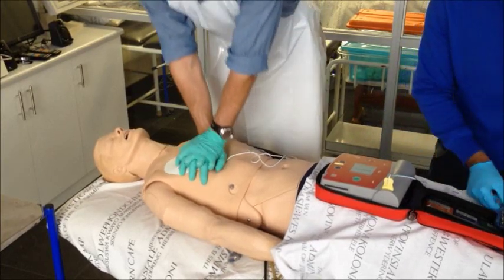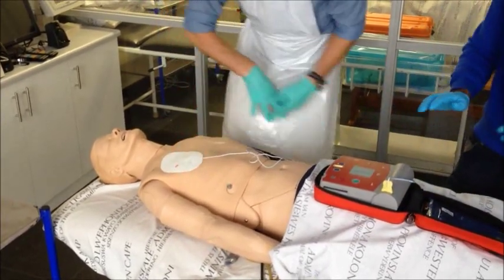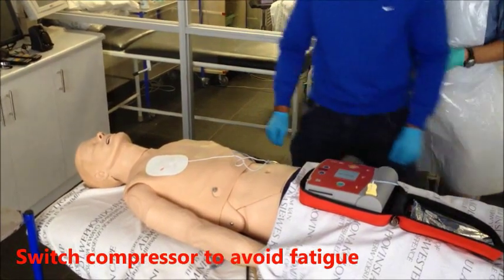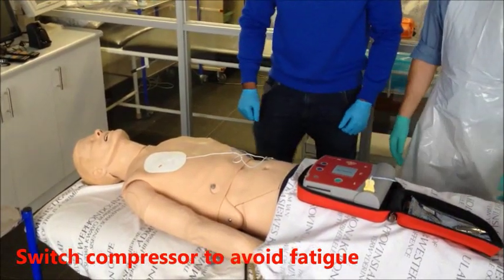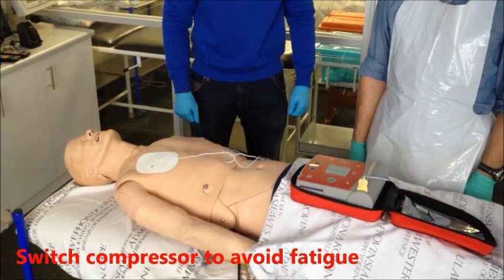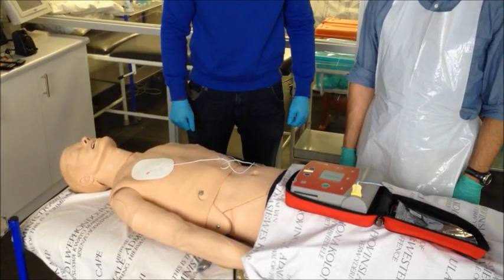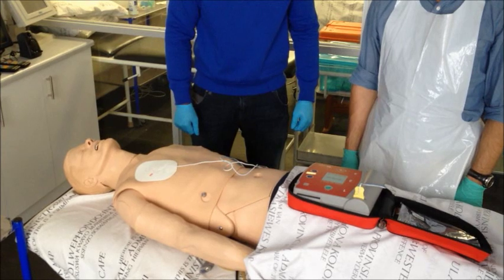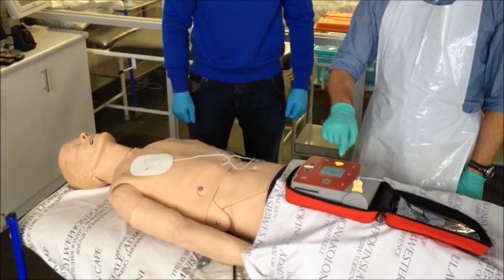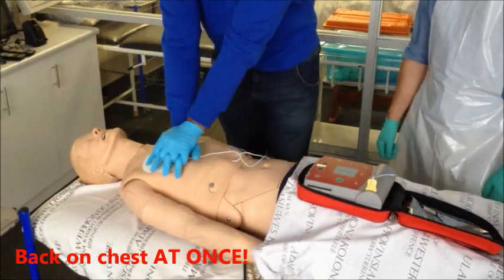Analyzing heart rhythm. Do not touch the patient. Shock advised. Charging. Stay clear of patient. Deliver shock now. Press shock. Shock delivered.